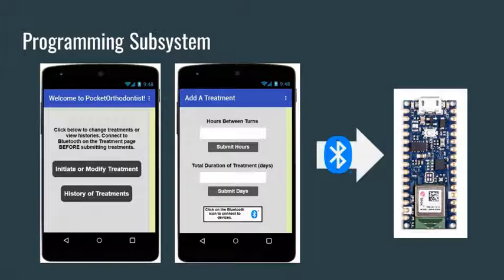When the code is running, digital pulses are sent to the encoder and motor portions of the circuit subsystem to initiate expansion when necessary. During the testing phase, we ran test code to ensure that physically unsafe instructions were rejected and to make sure commands sent to the circuit subsystem were reliable and repeatable. In terms of the device as a whole, this subsystem allows for remote adaptation and removes patient interaction entirely from the process of expansion.